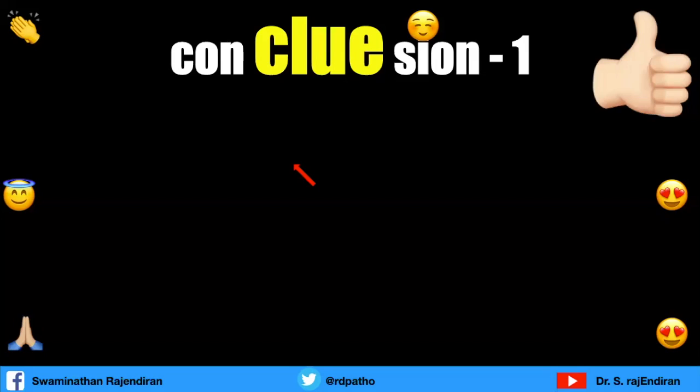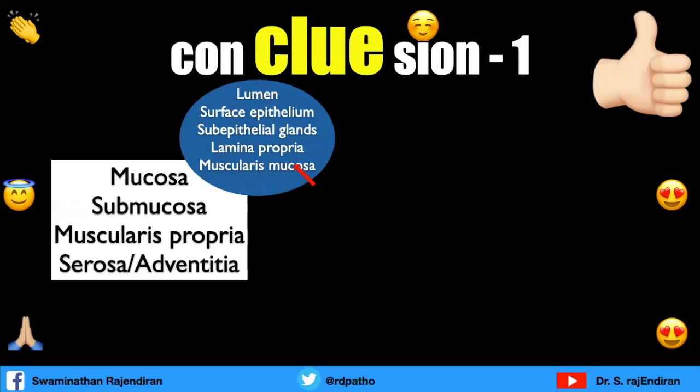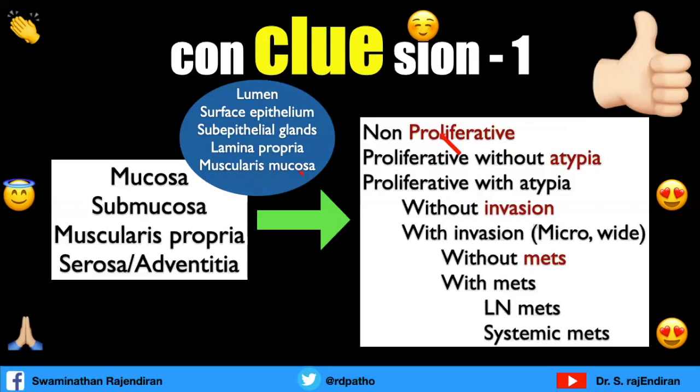So this brings the basic concepts learning to an end. I want to summarize. In the resection specimen, there are 4 layers: mucosa, submucosa, muscularis propria, and serosa or adventitia. In the mucosa, you have to see changes happening in the lumen, changes in the surface epithelium, subepithelial glands, in the lamina propria, and in the muscularis mucosa. And always remember to ask 4 questions. Is there any proliferation? Is there any atypia? Is there any invasion? Or is there any metastasis?